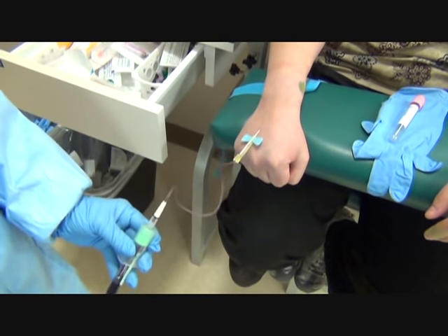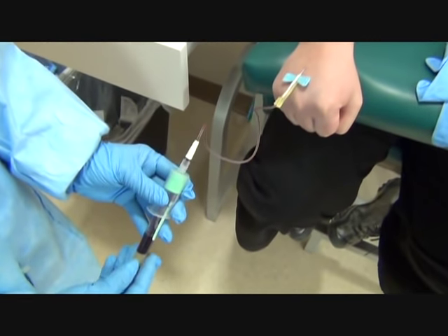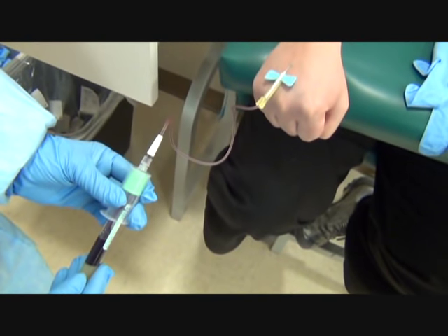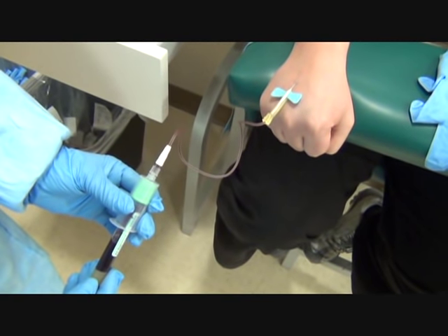Are you feeling okay? This is a hand vein, plus it is a smaller needle, so it's going to feel slower. I just have to be patient with it.